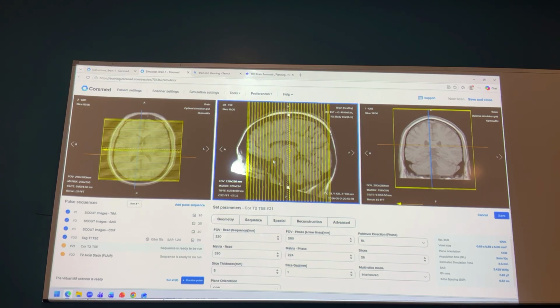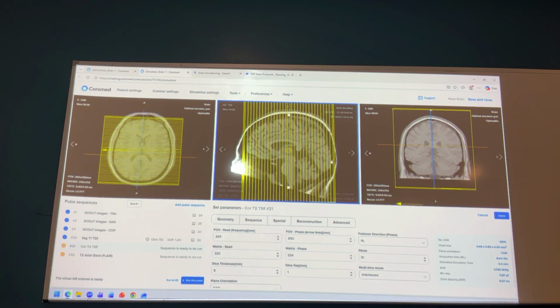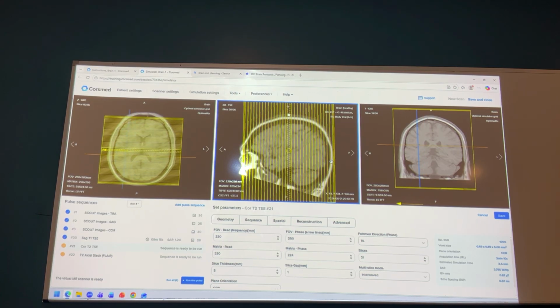But on slice 15, right here, this is cutting. So that's why I would like to add more slices. You can grab your stack and bring it to the right a little bit, until it looks like this. So from right and left, both are covering the whole brain, not cutting it.